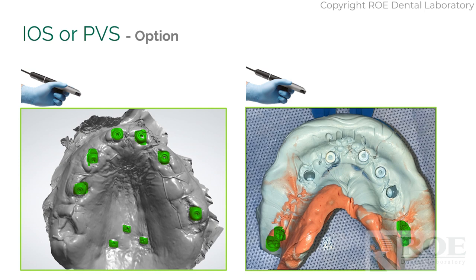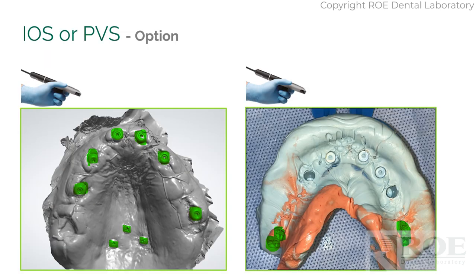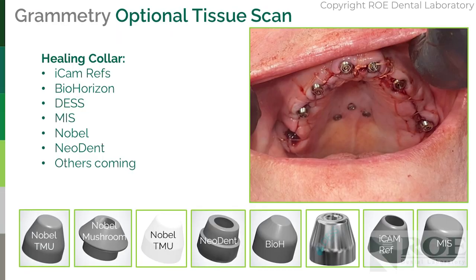But think of the simplicity you have here, right? You do a simple IVJ, simple IVJ, take it out of the mouth, quick. Put the healing collars in and suture around. The patient is almost done at this point. Take a PVS or take an IOS, patient's done. That's it. Patient goes home or patient goes and relaxes while we get the case ready.